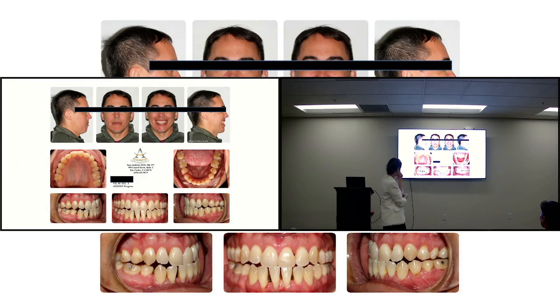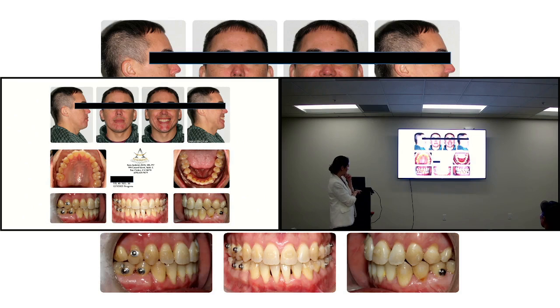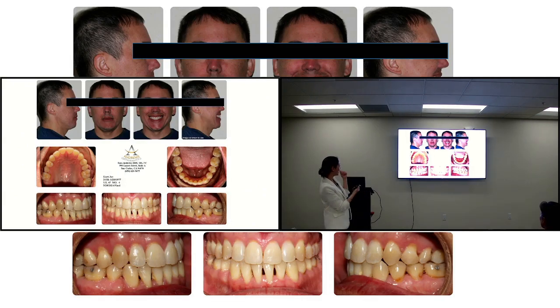So again, this is when we removed the braces and decided to finish in Invisalign. And this is progress. Then in Invisalign, I have to have buttons. But he's pretty nicely socked in on that right side. Of course, I created black triangles, which I don't like. But you know what? This is how he finished. I think he finished really, really nice. Maybe a restorative would be an option. This is where my restorative colleagues can help me close those black triangles. Maybe BioClear, I don't know.